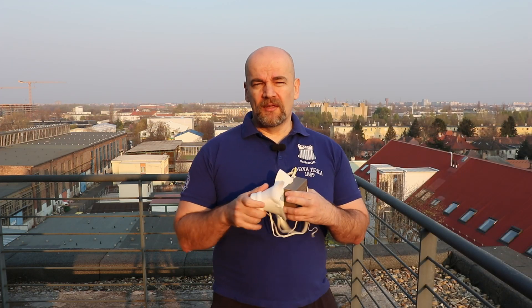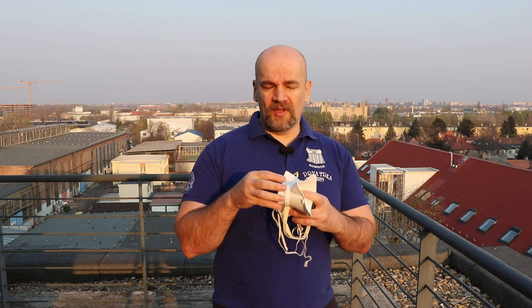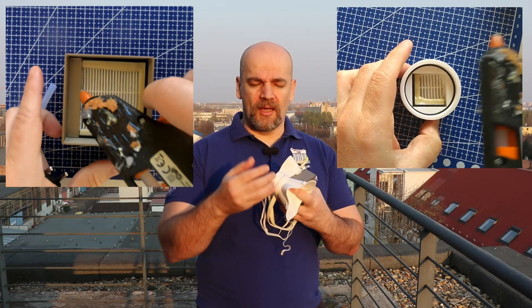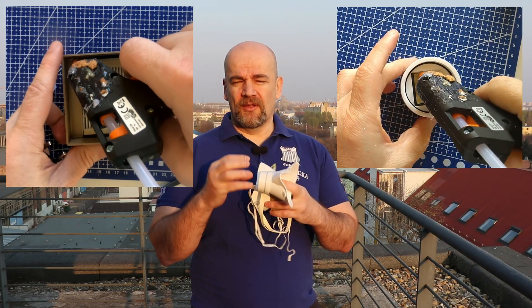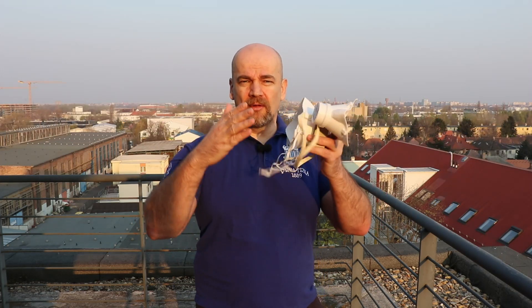We have three types of sealing. The first one is between the filter and the filter holder. My solution is hot glue. With hot glue I permanently connect the filter to the filter holder, and that will prevent air from going around the filter.